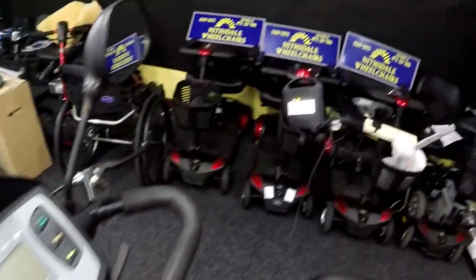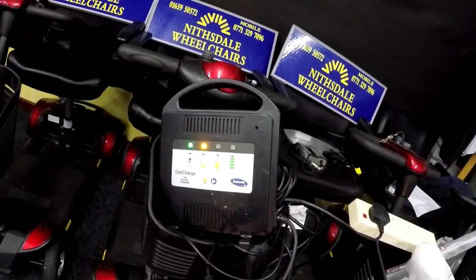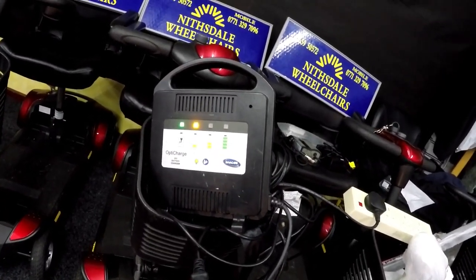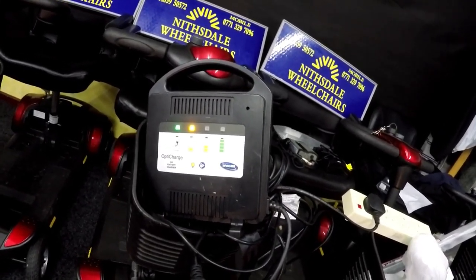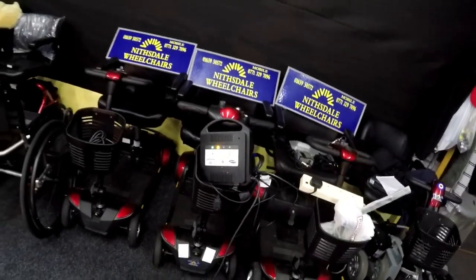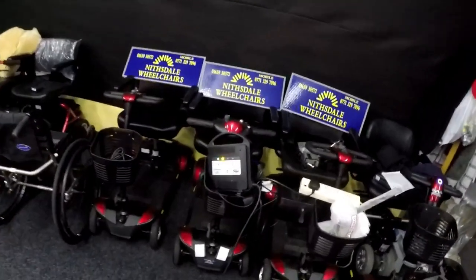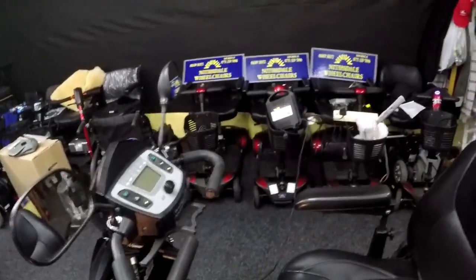So what's happening is when we're putting it on charge here, the power light's coming on and the orange light is coming on. The customer's saying that after a short period of time, the two middle orange ones come on and they start to flash, telling you it's a problem. Now that is really only done with the Opti chargers, that particular one there, quite a quality charger. So that's telling us one or two things.